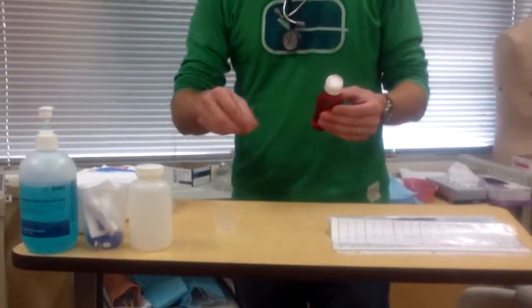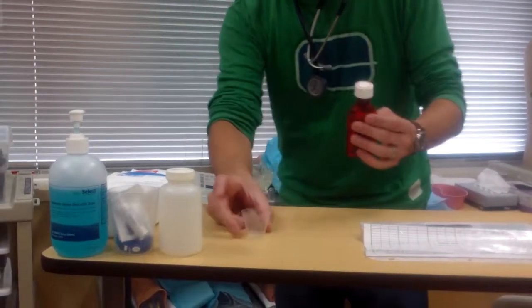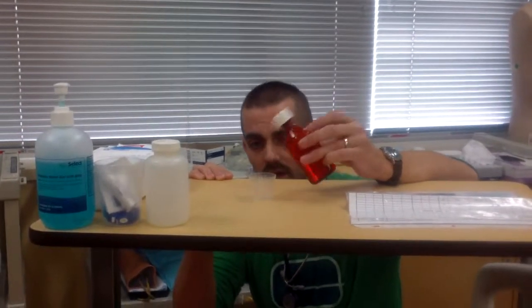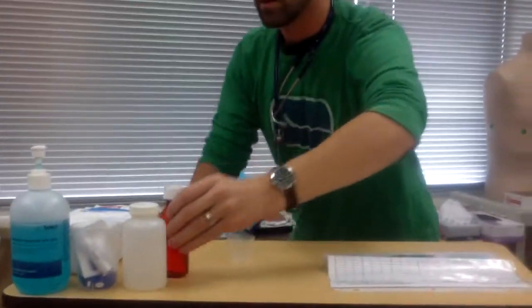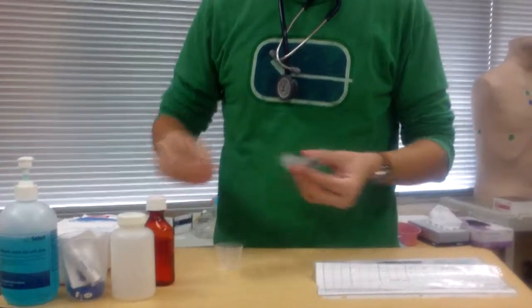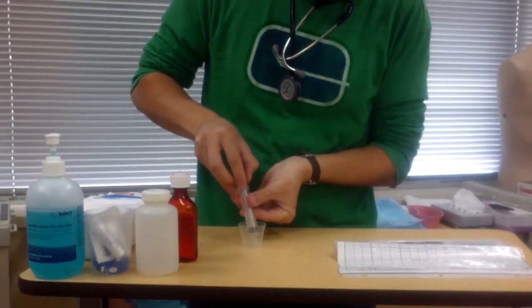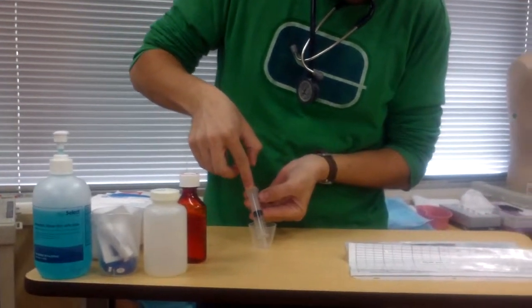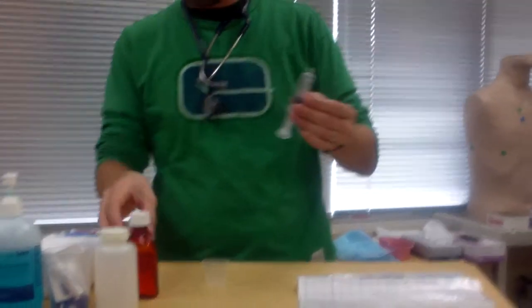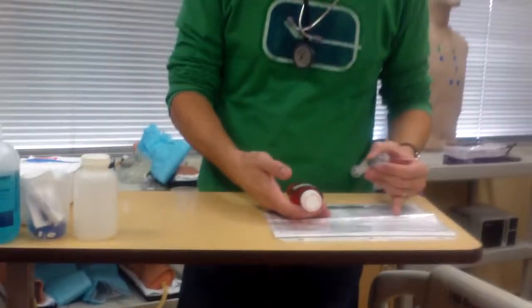So now I'm going to open this up. I'm going to get down here at eye level. I'm going to pour 10 milliliters into my cup. Okay, that's good. I have my syringe here. I'm going to open this up. I'm going to aspirate all of the contents in this little cup. Then that equates to 10 milliliters. So that's good. I'm just going to double check that against my MAR.